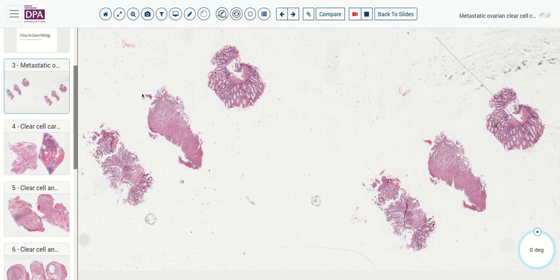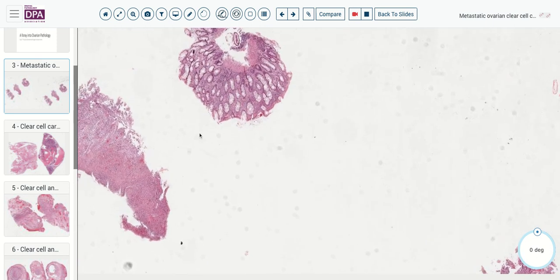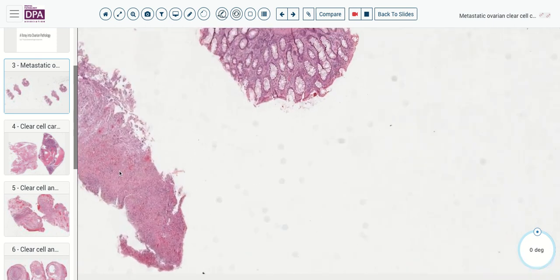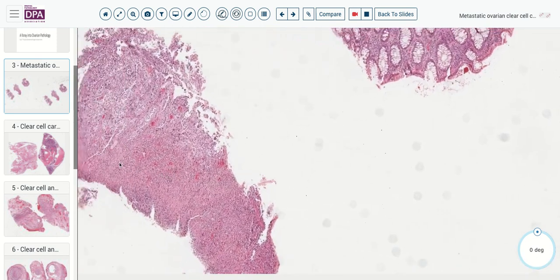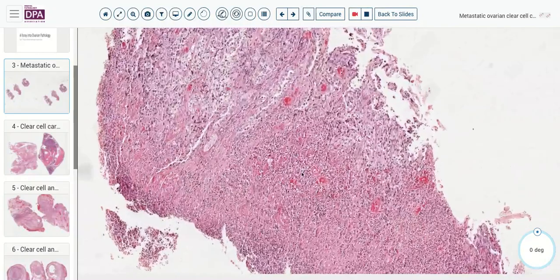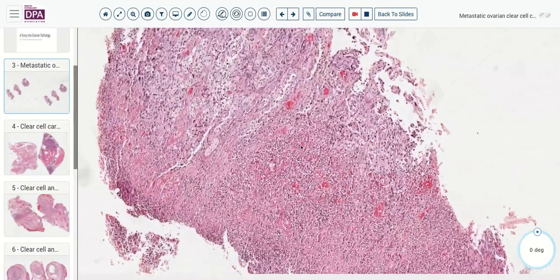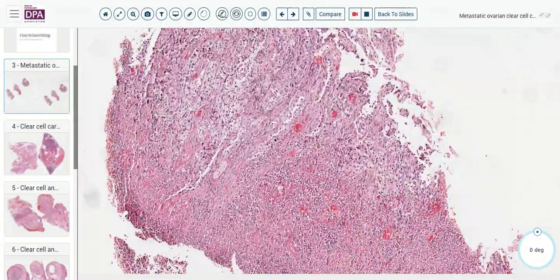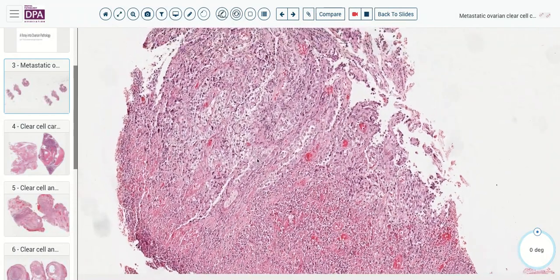Here we can see several biopsies. This looks like colonic mucosa, fairly normal, a very abnormal fragment, and a sort of in-between fragment. Looking first at this abnormal fragment here, we can jump fairly quickly and see that this is an adenocarcinoma.